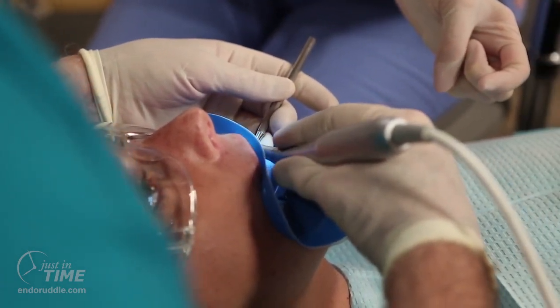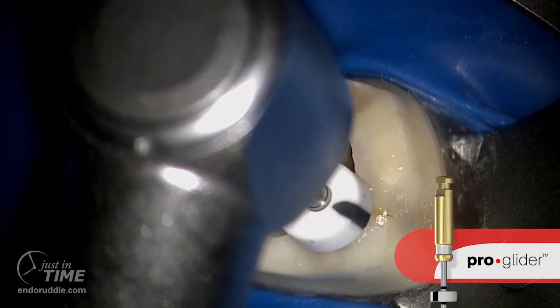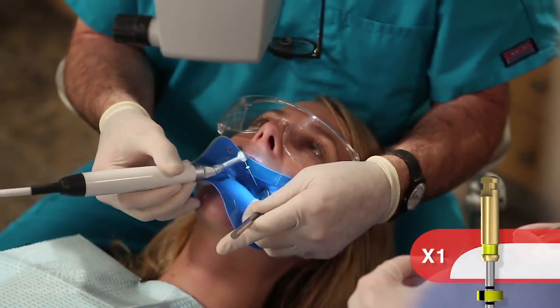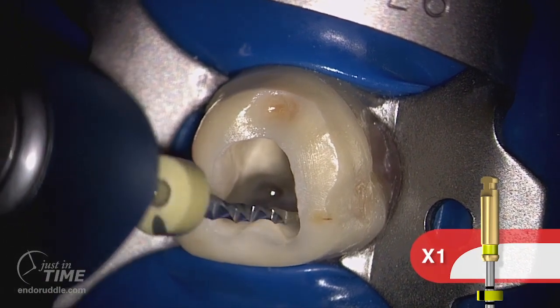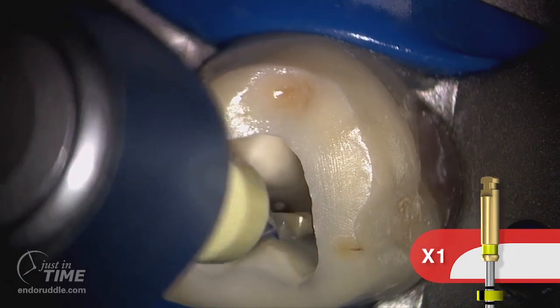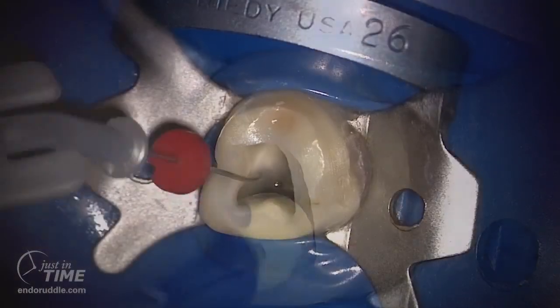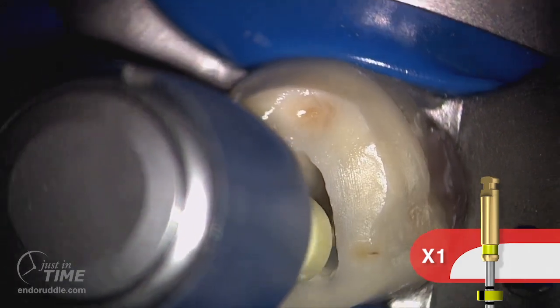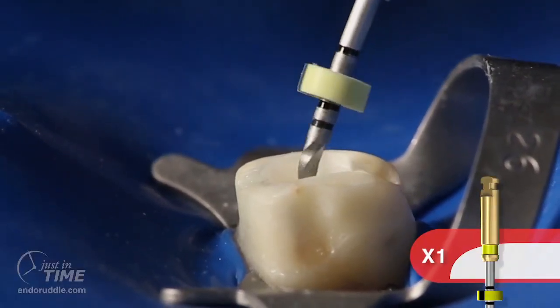This progressively tapered single file expands the glide path more than all other dedicated mechanical glide path files available today. Once we have an expanded and reproducible glide path, we can commence shaping using the ProTaper Next X1 file. Notice its unique asymmetrical rotary motion. Appreciate that I'm brushing to improve contact between the instrument and the dentinal walls. Oftentimes when a file bogs down and doesn't want to progress and move apically, understand a considerable amount of dentinal mud has been produced. So irrigate, recapitulate with a 10 file and then re-irrigate to liberate this debris. In one or more passes, we can continue with the X1 file using this brushing motion. Brushing allows us to effectively work into the eccentricities off the rounder parts of canals.